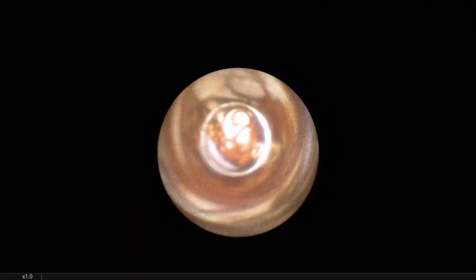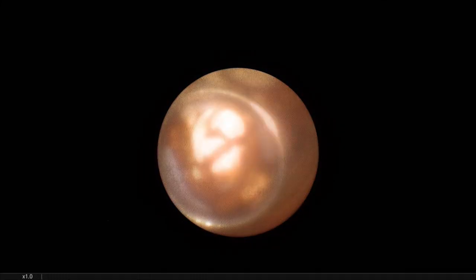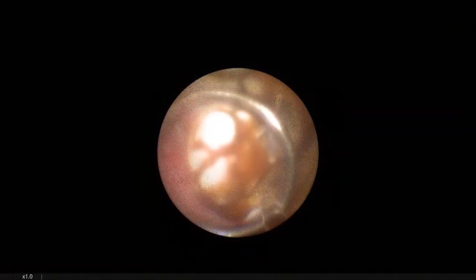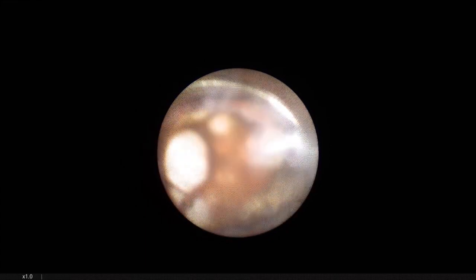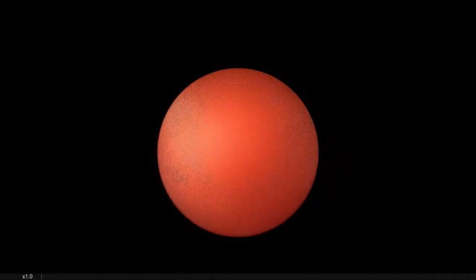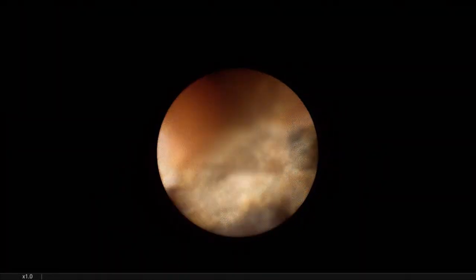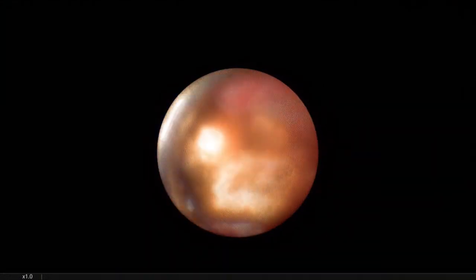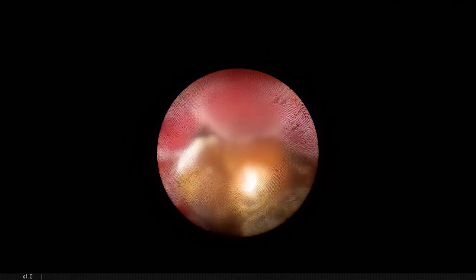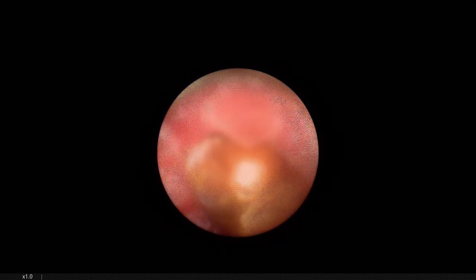Go to ready. Okay, just a moment. It's still hard, huh? No, it doesn't matter. The interesting thing is that the stone always moves to the tip of the Amplatz sheath. And this can only be done in mini PCNL. Foot pedal, a little more. Come toward you. Okay. The distance is so close that you cannot move farther away.